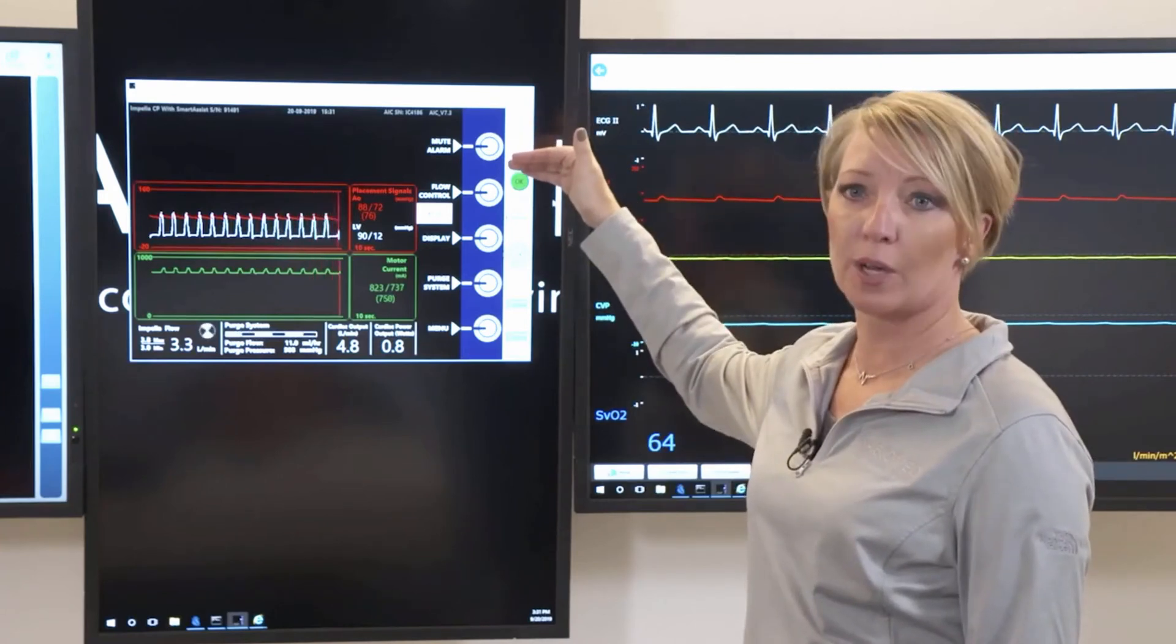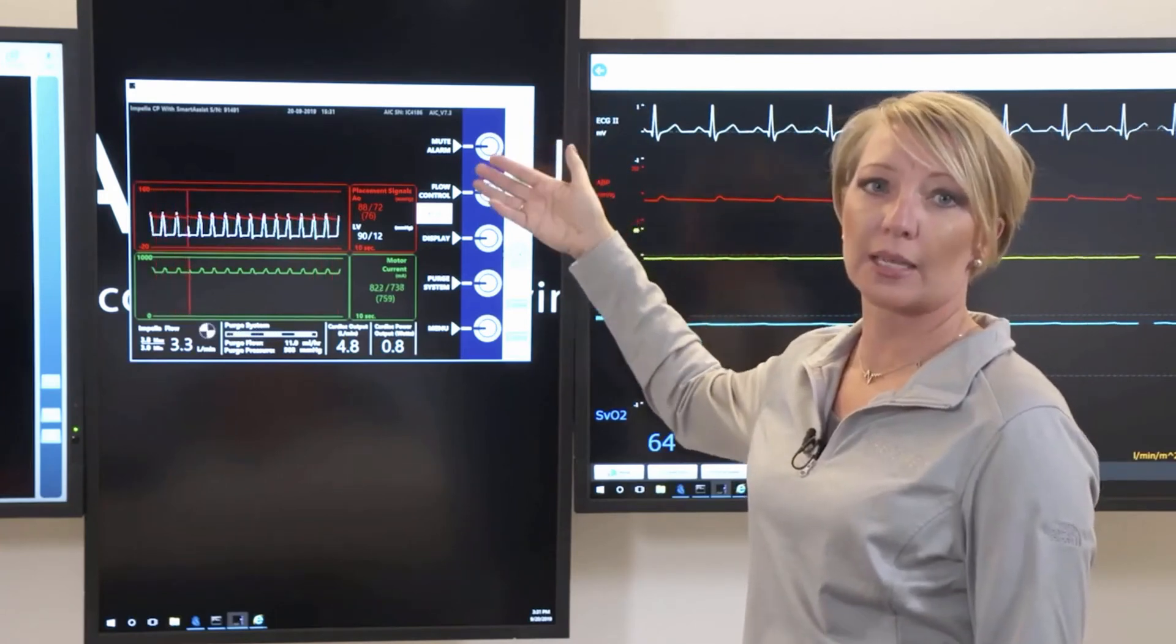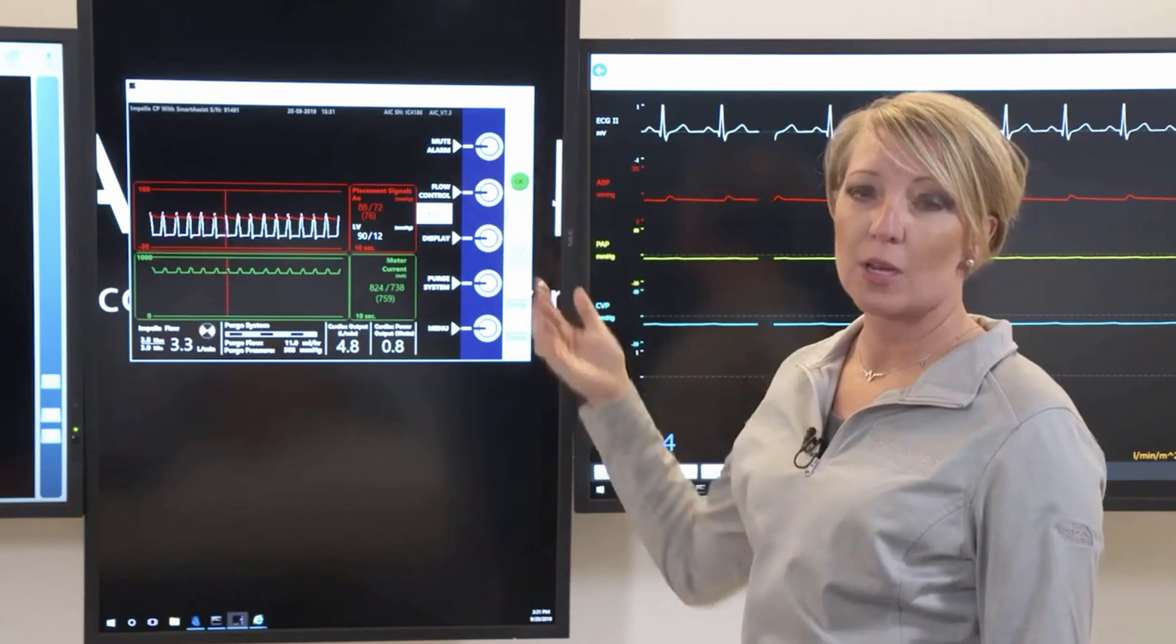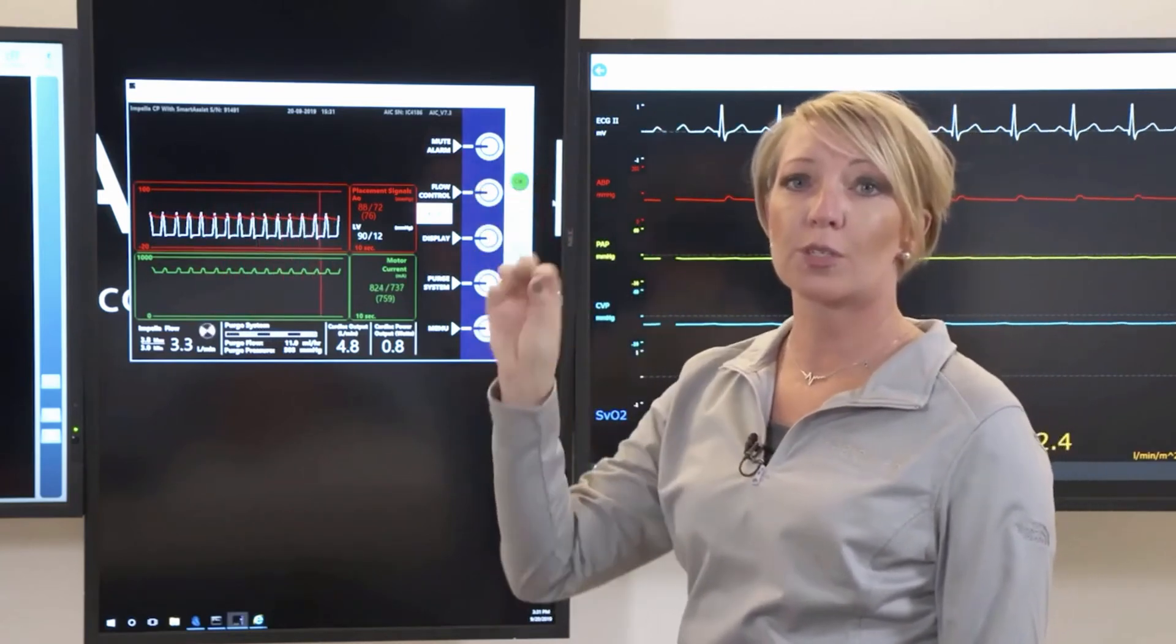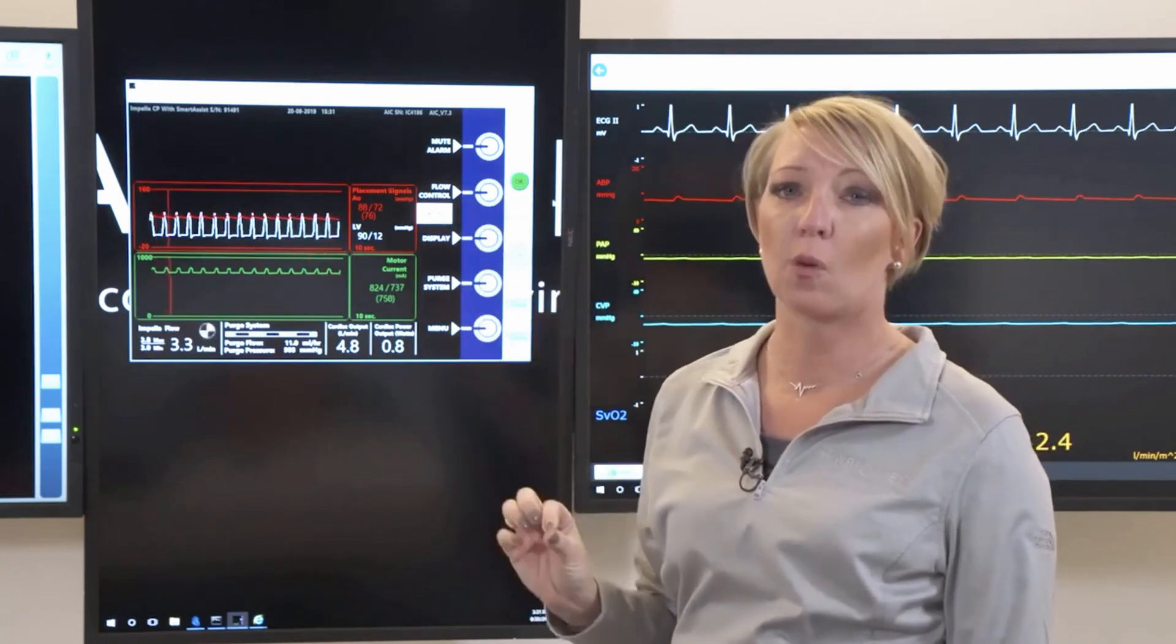The first button is our mute alarm button. This is going to silence any alarms that you may have. It is important to understand that there are three different colors of alarms, in order of importance: red, yellow, and white.